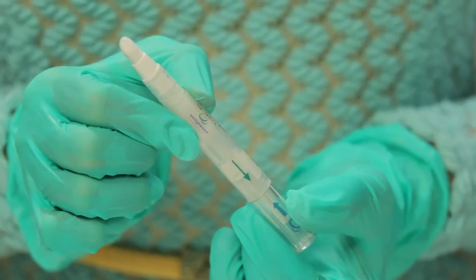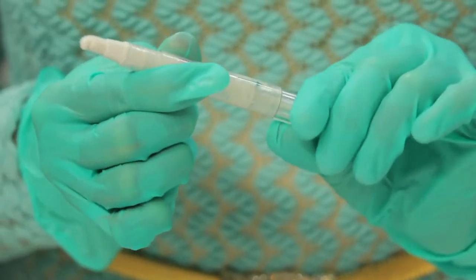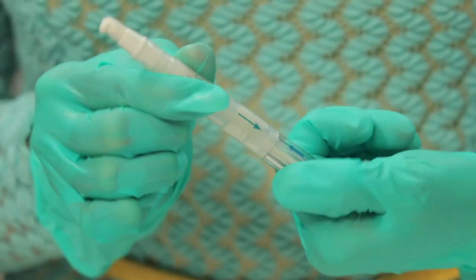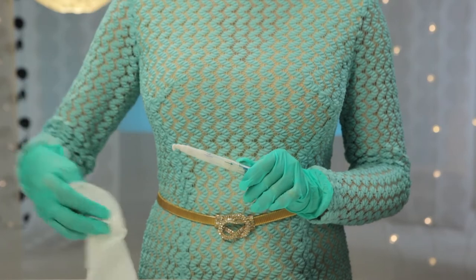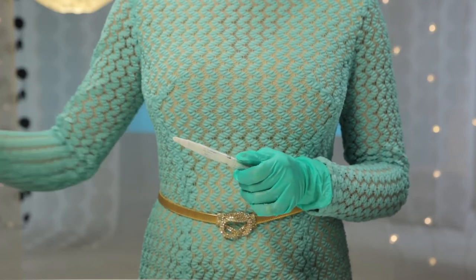At this end of the Twisted Dose applicator, you'll see arrows pointing at each other. Turn the end with the left-facing arrow until it realigns with the right-facing arrow. Now wipe the applicator tip with a tissue and throw away the tissue.